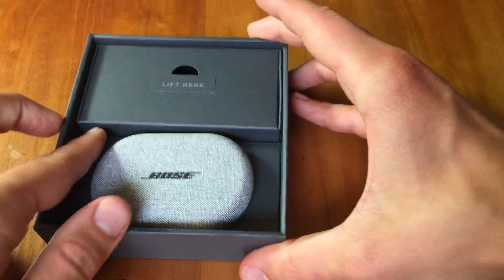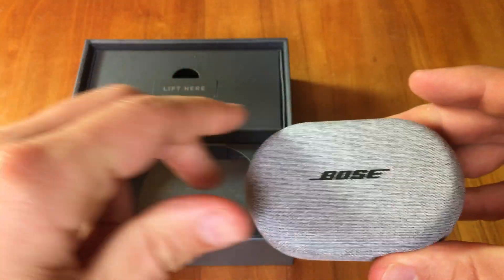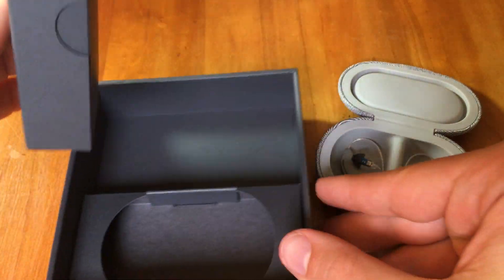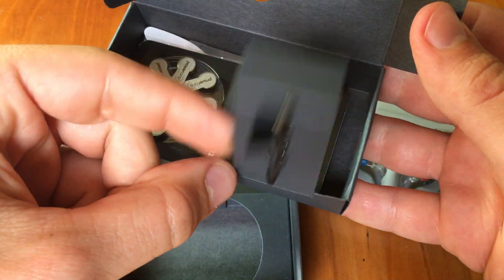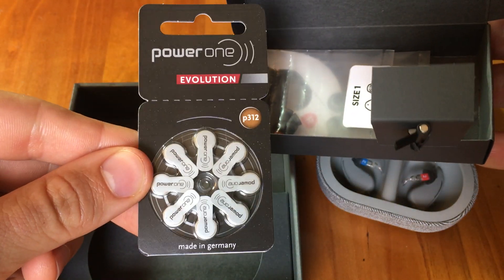Now let's show what we get here — the hearing aids themselves, the SoundControl hearing aids. Also inside the box, lifting that open, you can see it comes with a brush for cleaning and some standard size 312 hearing aid batteries.